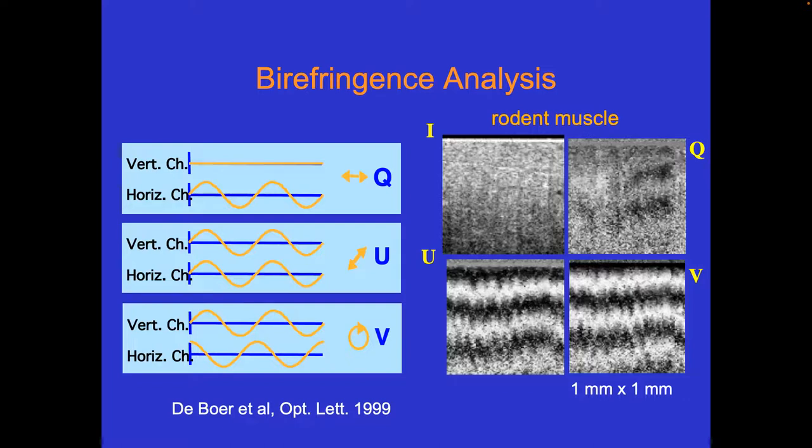Like I said in the beginning, what completely characterizes the polarization state is amplitude along X, amplitude along Y, and the phase difference between the X and Y component. And all these three parameters I can extract from this measurement. In one measurement, I can completely characterize the polarization state. That's interesting because if you go back in history, if you want to properly characterize the polarization state, you needed four measurements because it was intensity based. If you do it in this interferometric way, one measurement is enough.